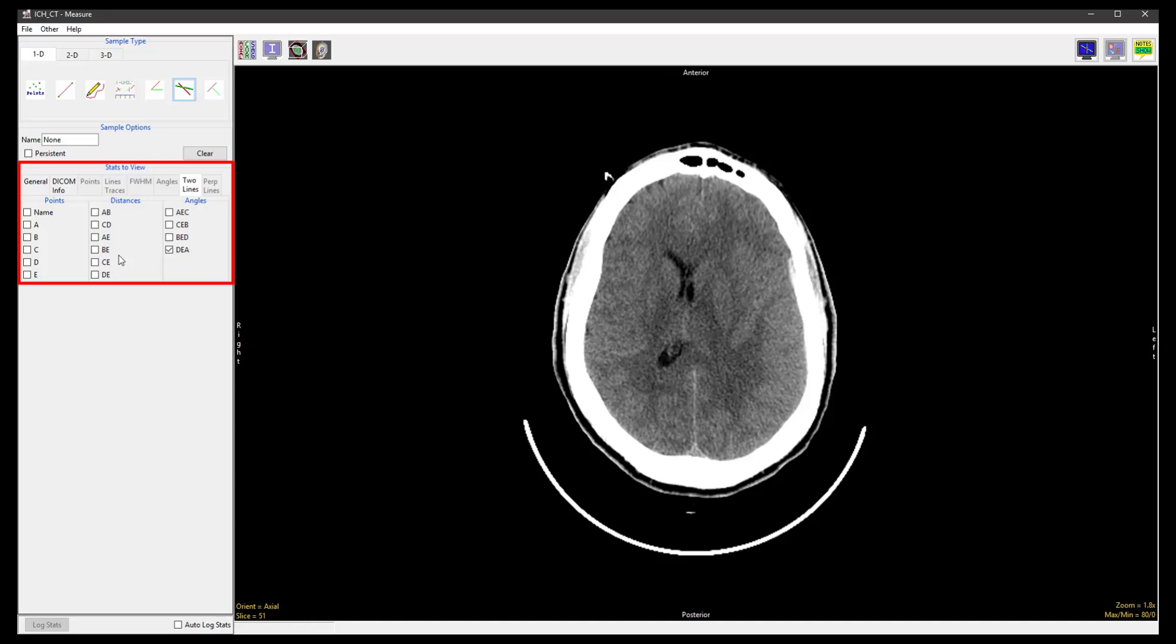To begin, we will randomly select distance CE and angle DEA. Next, we will define the two lines on the image.